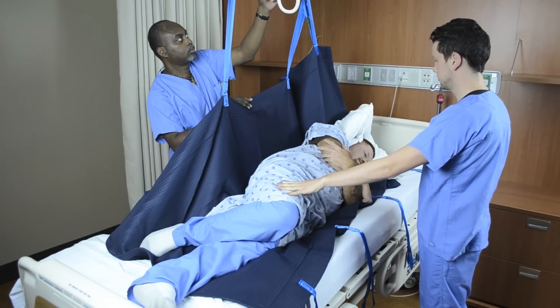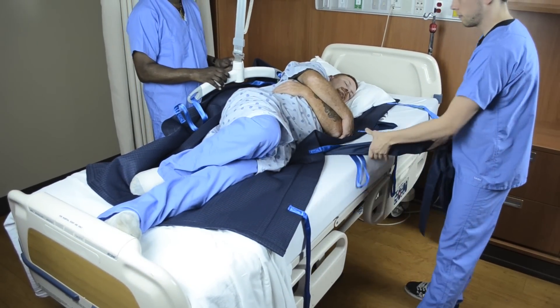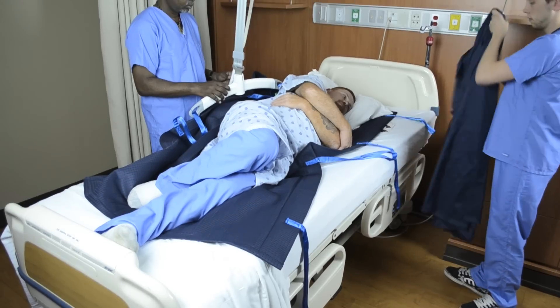Once turned, place pillows behind the patient to maintain the position. When the task is complete, remove the sling from the carry bar and remove the folded slide sheet.